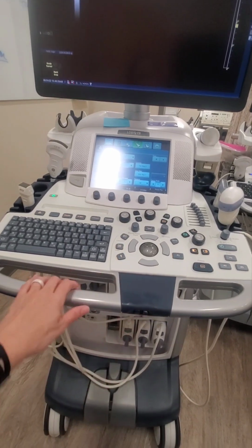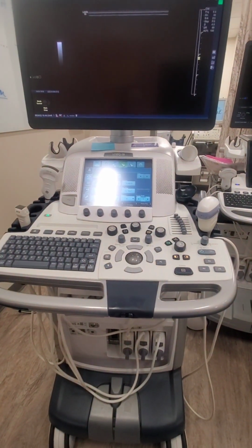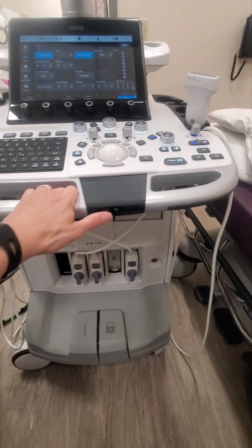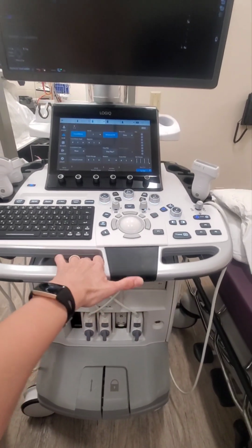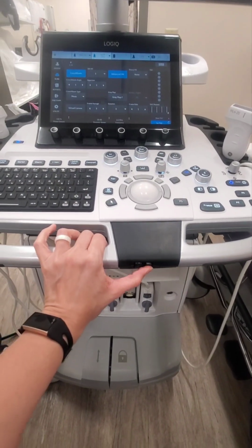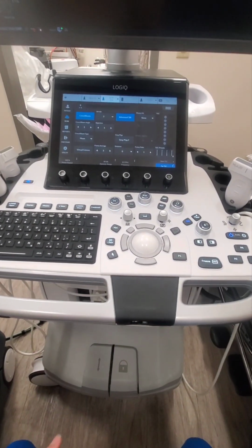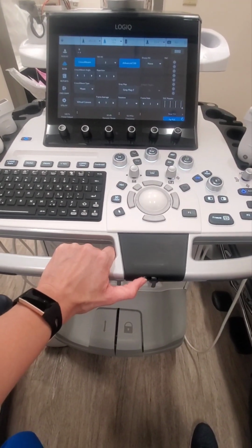This console. Now in ultrasound, your ergonomics and keeping your body safe while you're scanning is very important. The consoles move, okay? You can bring this all the way up if you want to stand and scan. You can bring the console down if you want to sit and scan, okay? You can bring it right to your appropriate height level. This button here will unlock the console.